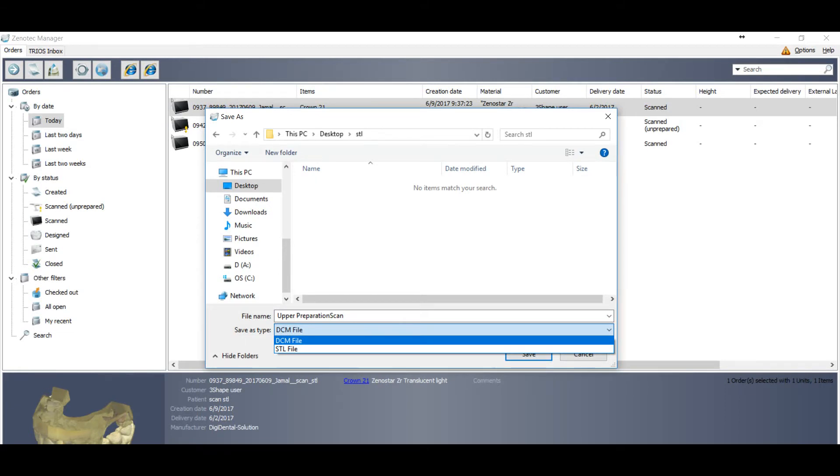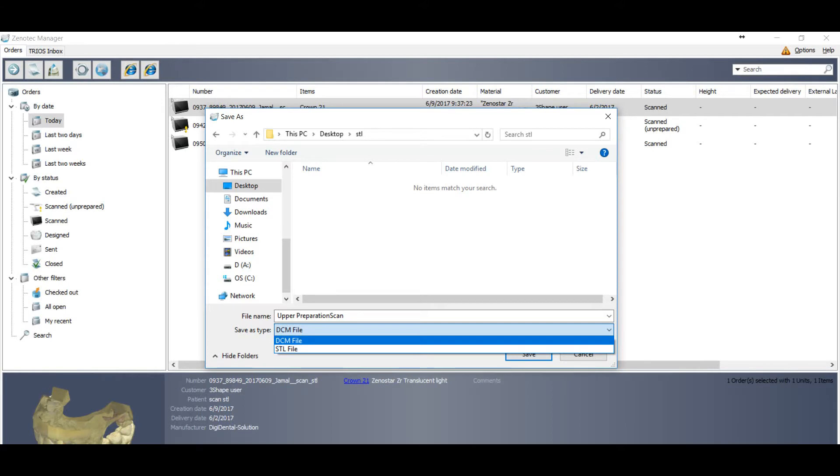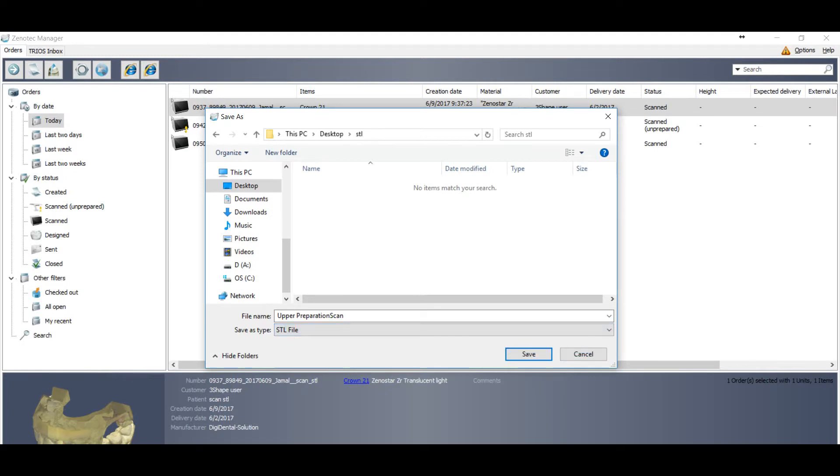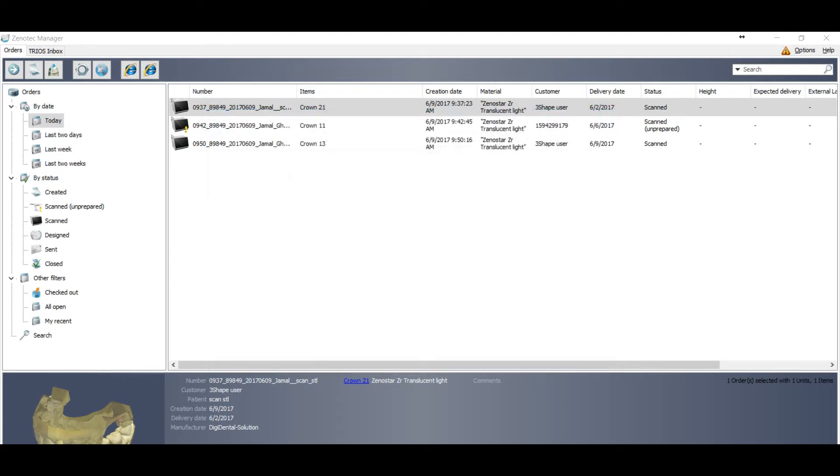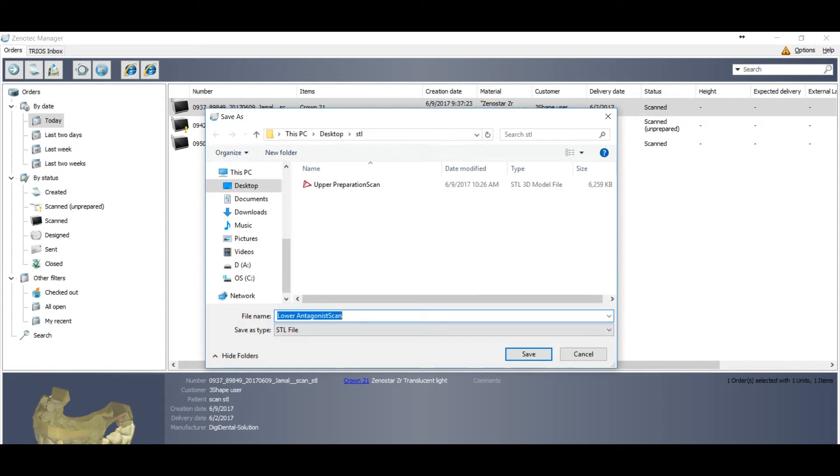So this is the first way. But if this option is open on your dongle then you can use it. Most of the dongle option is not open, so you have to ask your reseller to open for you. So this is the easiest way to convert your files, desktop scan DCM files into STL.